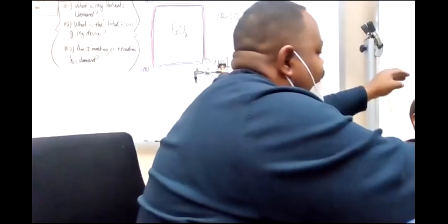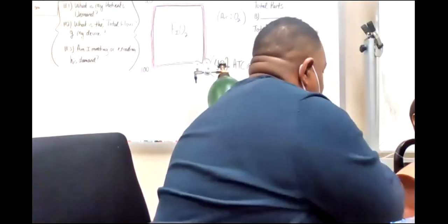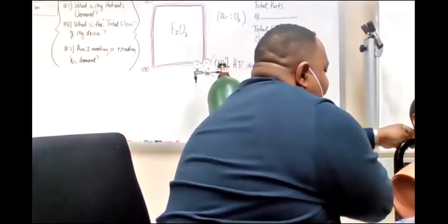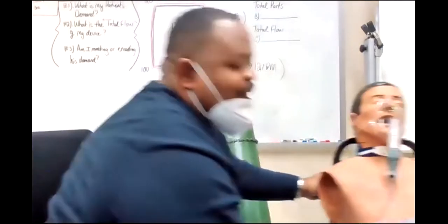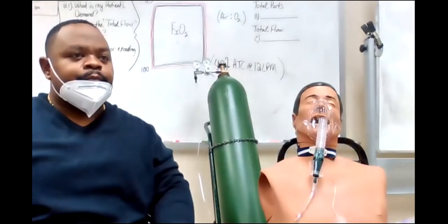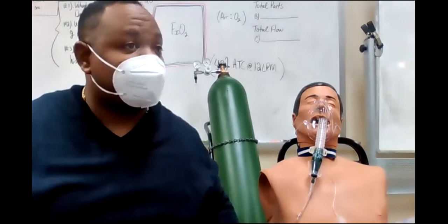FiO2. I can guarantee the FiO2. Well, this will go behind his ears, of course. But I can guarantee the FiO2, and it doesn't matter how he's breathing. It does not depend on his ventilatory pattern if it's a high flow system.